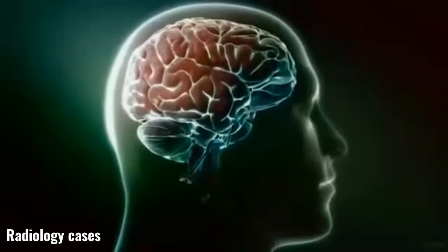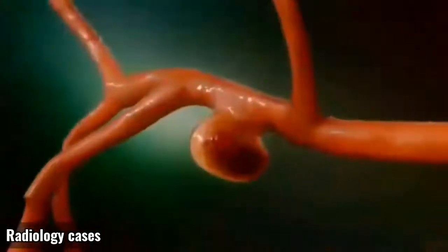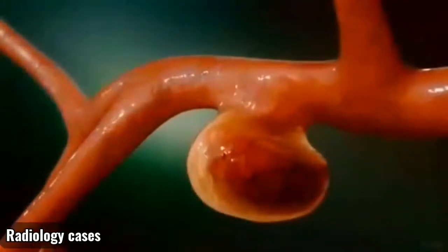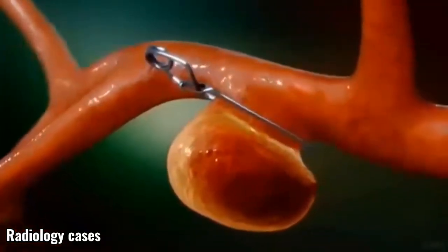During microsurgical clipping, a small metal clip is used to stop blood flow into the aneurysm. A craniotomy is performed to create an opening in the skull to reach the aneurysm in the brain. The clip is placed on the neck opening of the aneurysm to obstruct the flow of blood and remains inside the brain.